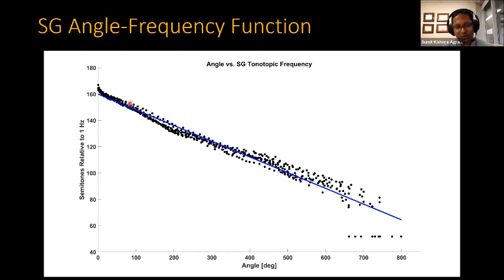Now, the reason that we weren't able to do something a bit more patient-specific on the spiral ganglion is that we can't really predict its length in an actual patient. Unfortunately, the spiral ganglion doesn't correlate well with either the number of turns of the cochlea or the lateral wall length. So on a clinical CT, it's very hard to know how long a specific patient's spiral ganglion is going to be. So that's the reason we just use a simple linear regression for now.